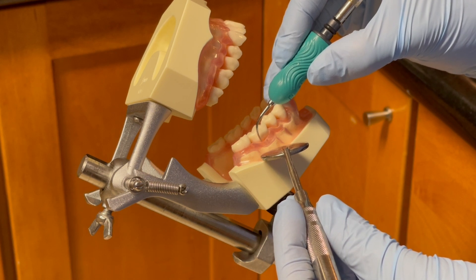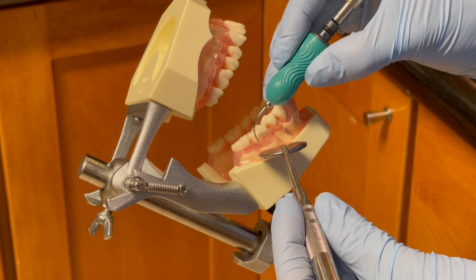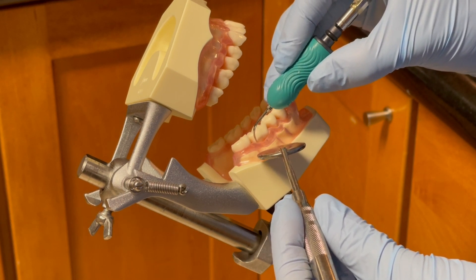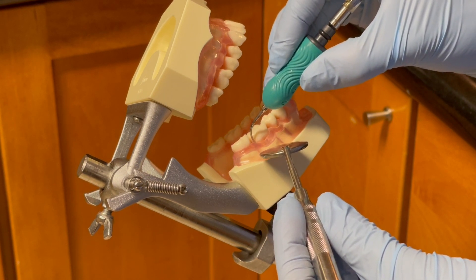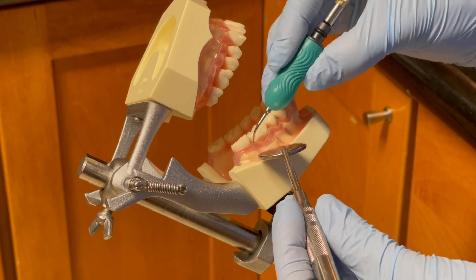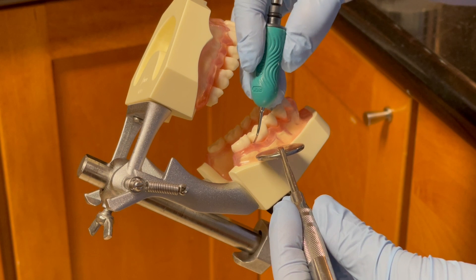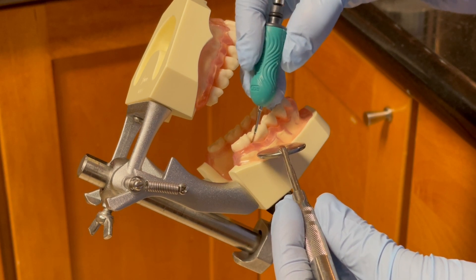I activate the USS using constant, well-controlled small 1 to 2 mm overlapping strokes, moving from the top to the bottom, covering all surfaces of the root in a systematic manner. I work the tip all the way from the distal buccal line angle to the distal interproximal. When touching the contact area, I change to transverse orientation, use the side of the tip adapted to the tooth, use vertical strokes, and finish the distal interproximal surface.